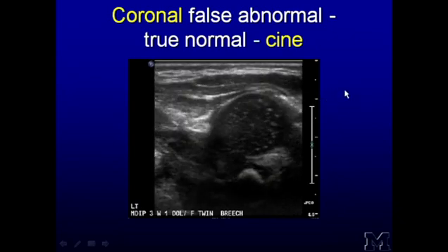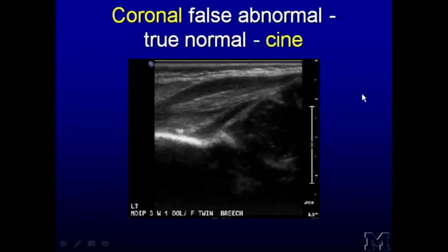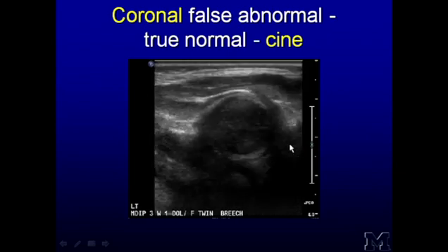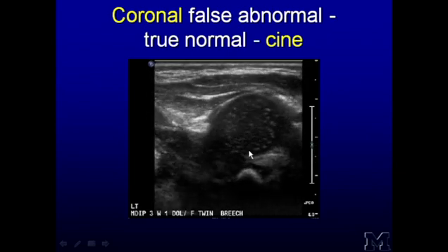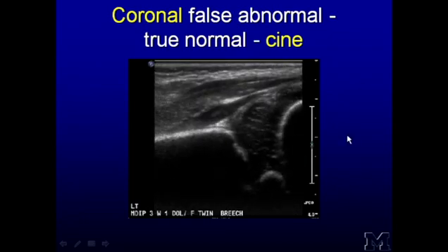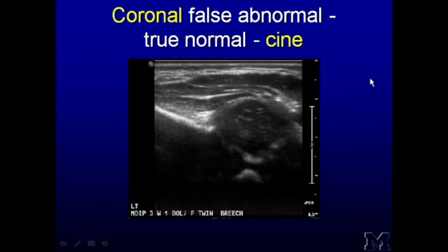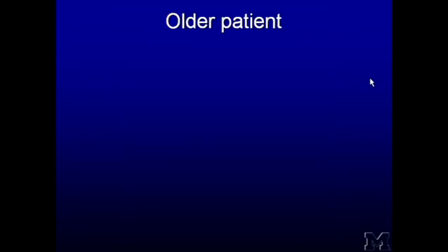All these things can happen to the transducer with respect to the lateral aspect of the body. You can make it look very abnormal. And you can see if you just froze on that picture right there, you would think that's a very dysplastic, shallow acetabulum with a steep roof, but it really is just an artifact of projection. So this comes with experience, and then hopefully having the proper orientation of mind will help a lot.